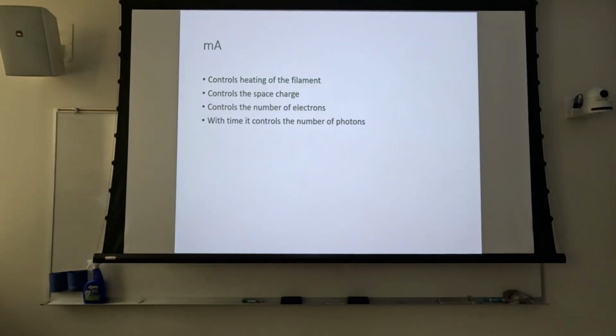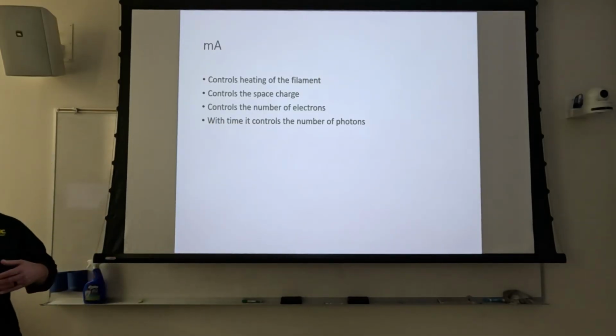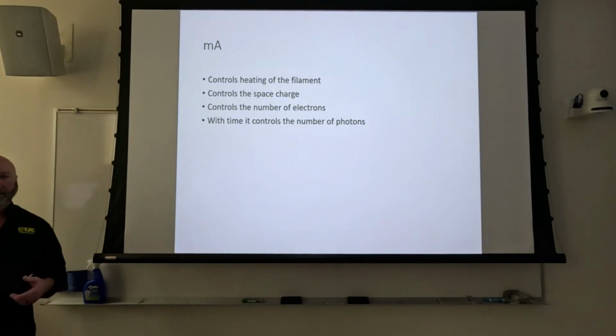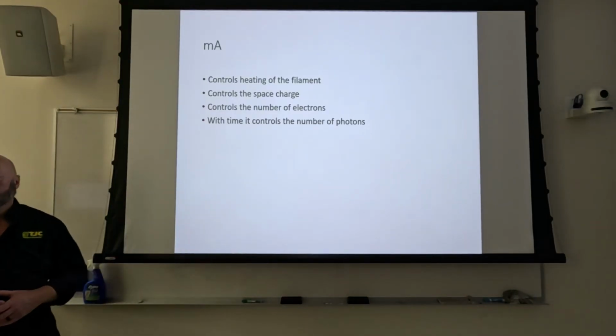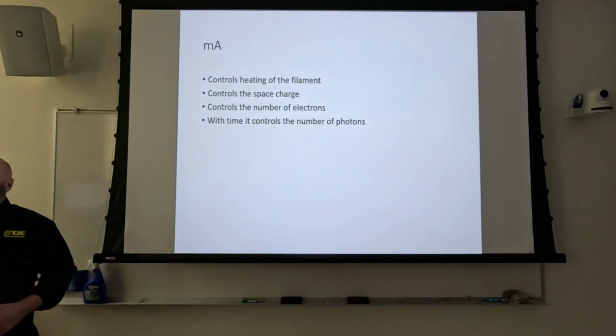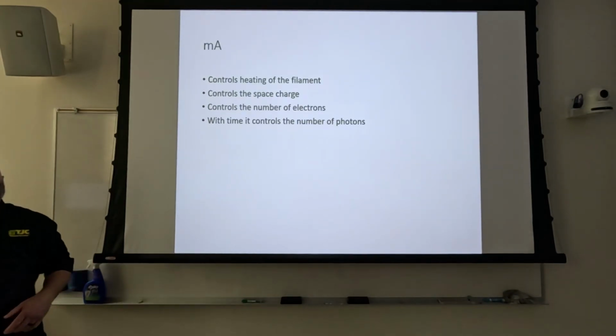All right, so let's park on this for just a second. And I know we're going to talk about it later on. But we're right here in the freshman class, so some of the things that I'll talk about in freshman class, we haven't talked about in this class. So the space charge, remember, if you over prep, right, you hold the prep button down long enough, what do you get? Blooming is space charge. Also, if you use a very high mA station, you can also get blooming as space charge.